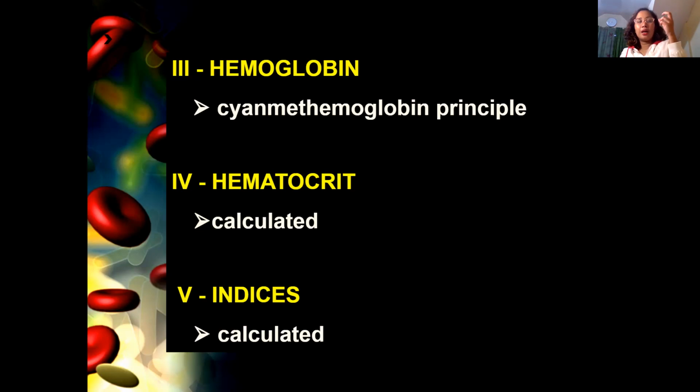So the dilution, or how dark or how light the solution becomes, could affect hemoglobin. For example, in cases of lipemia, where the EDTA tube we put into the analyzer is milky, it could produce a falsely high hemoglobin result, because it uses a spectrophotometer.